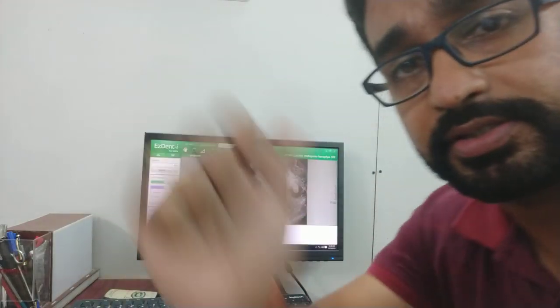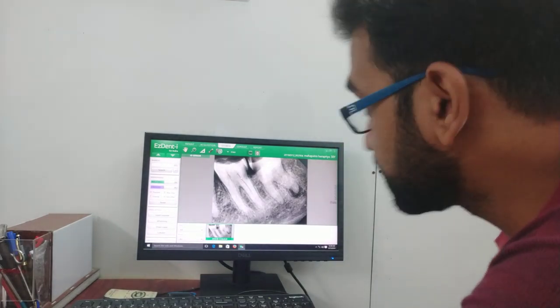Hey guys, welcome back to the channel. Today I want to discuss some of my cases — important and good cases — and how we approach diagnosis and treatment planning. If you are watching this video for the first time, I am Dr. Abhishek, working as a reader in the Department of Oral Medicine, Bhubaneswar. I make videos on anything related to dentistry. So these are my X-rays — let's see the first patient.